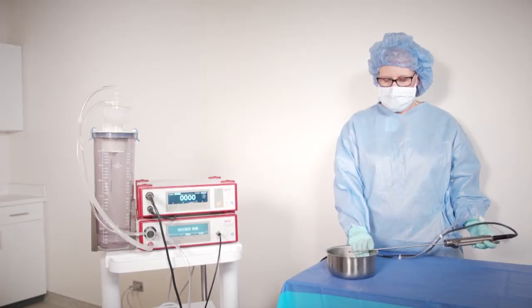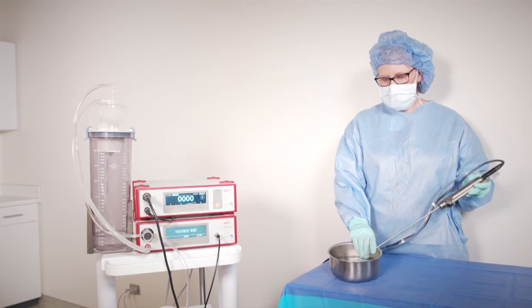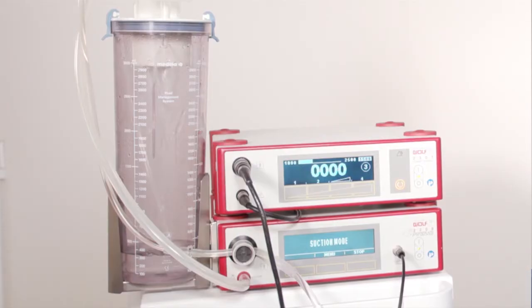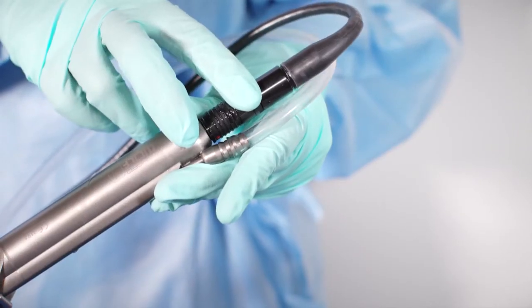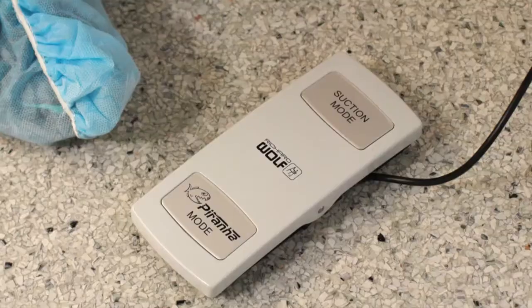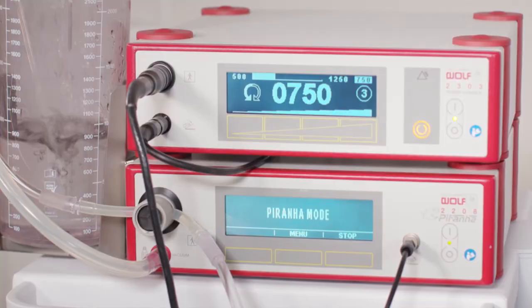To test the blade as recommended per the IFU, immerse the tip of the blade in liquid. Press suction mode on the footswitch until fluid passes through the power stick and tubing and into the secretion container. With the tip of the blade still submerged, press Piranha mode on the footswitch. Listen and look for the oscillation of the blade.